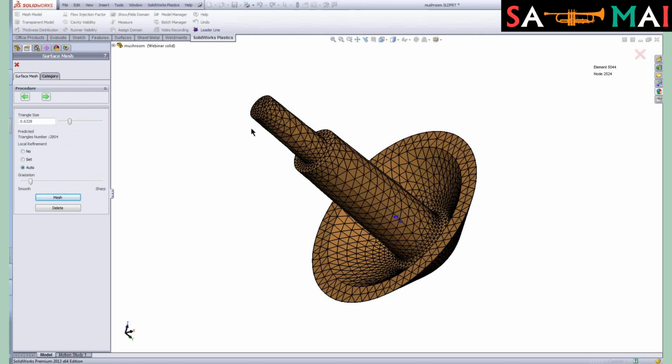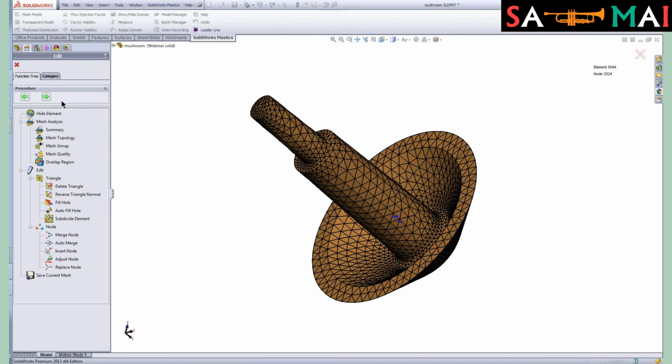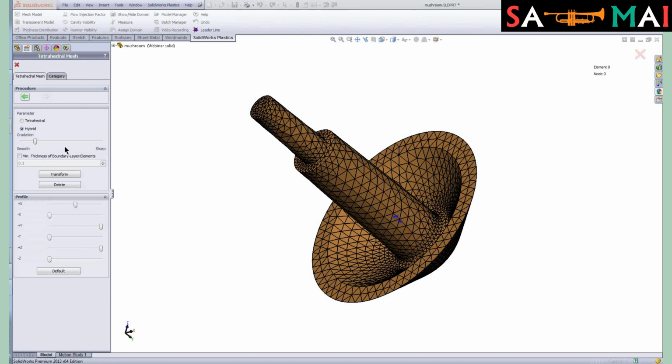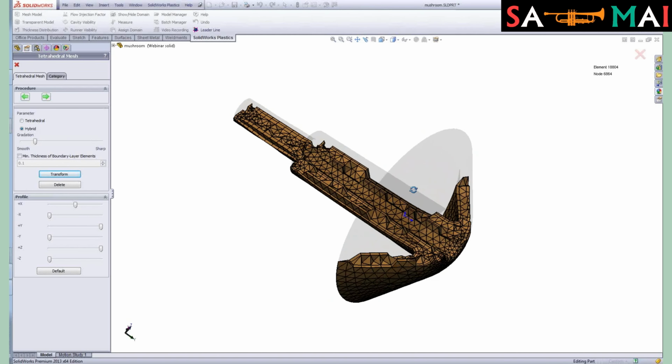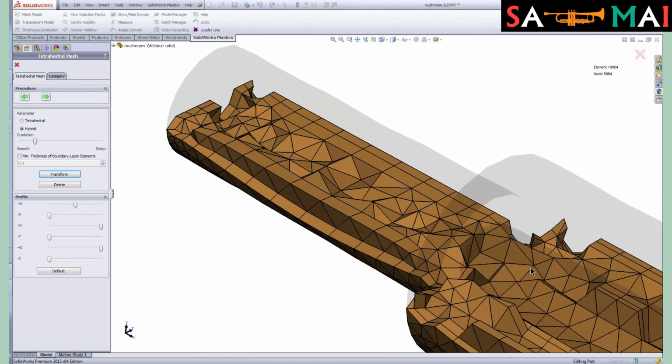So the first step in generating a solid mesh is basically to mesh the surface of the part. And then once I have that completed, what we're going to do is choose the type of solid mesh that we're going to develop. We have a couple of different meshing technologies here. I'm going to use a hybrid tetrahedral. And basically when I click the transform button, that meshes from the outside surface of the entire part to the volume. As you can see here, now I have solid elements throughout.